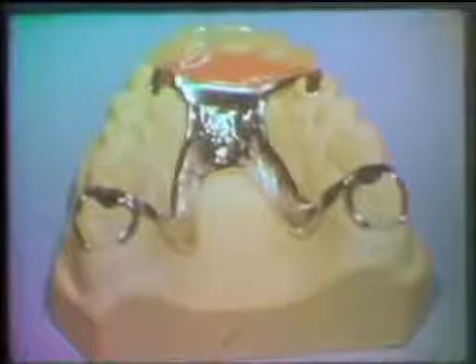The effectiveness of the rigid retentive component is dependent upon the conventional clasping utilized in the design. When the partial denture is in place, the rigid retainer remains passive, since no flexible component exists.